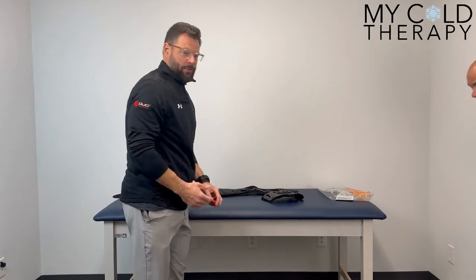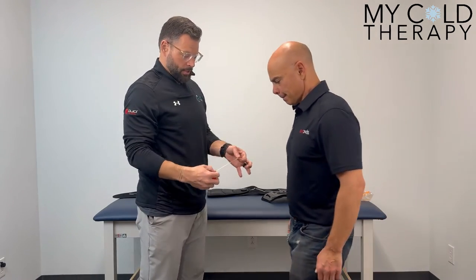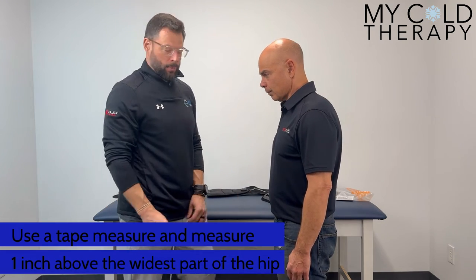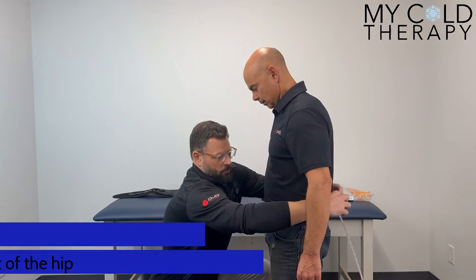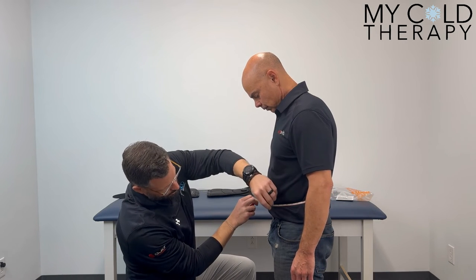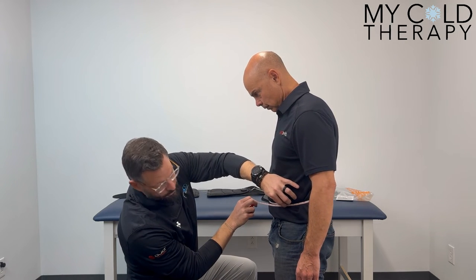How to size: you're going to have your patient take a soft tape measure. You're going to measure one inch above the widest part of the hip. So on Steve here, we're going to come along and measure right at roughly 36 inches.